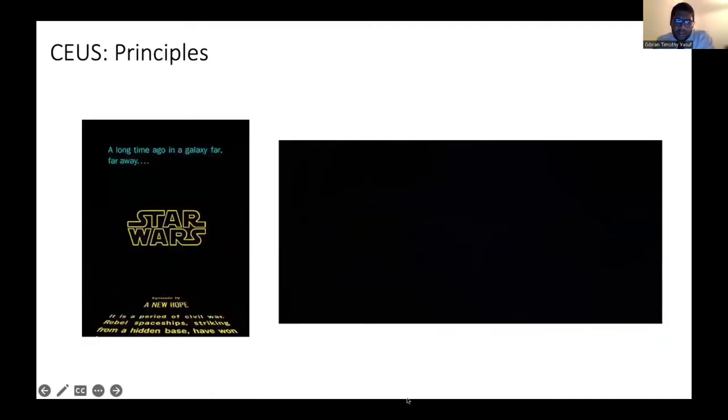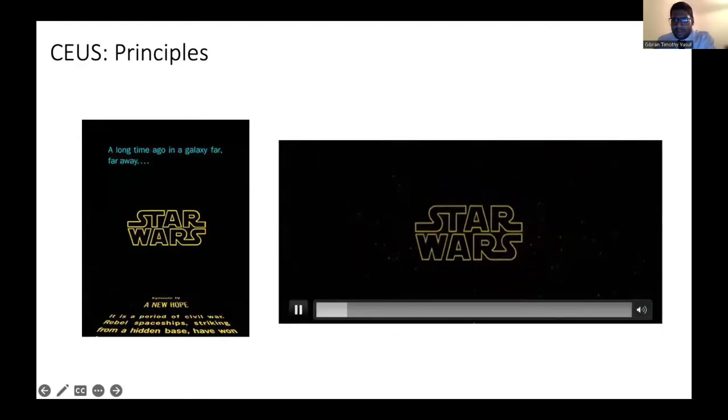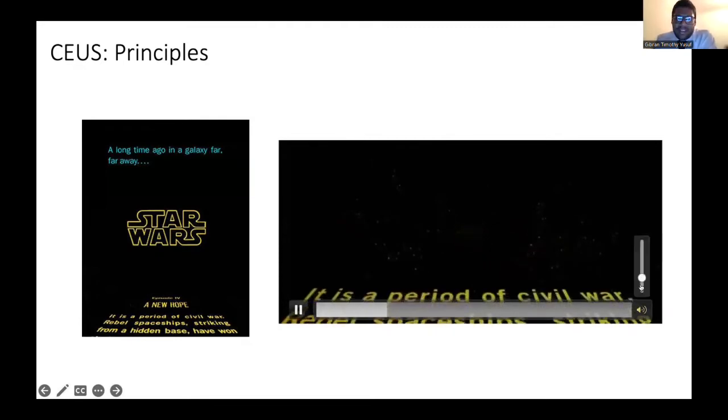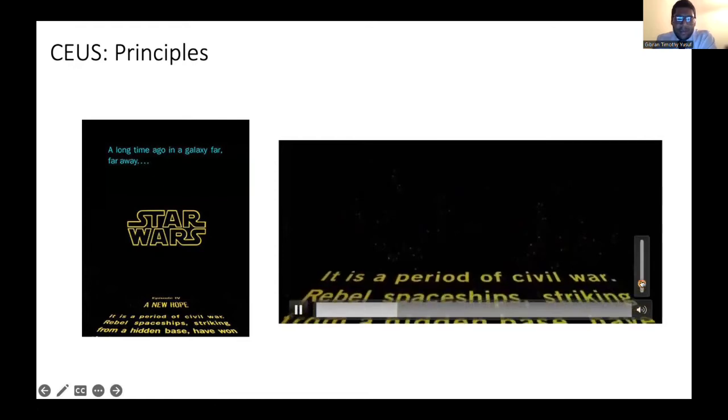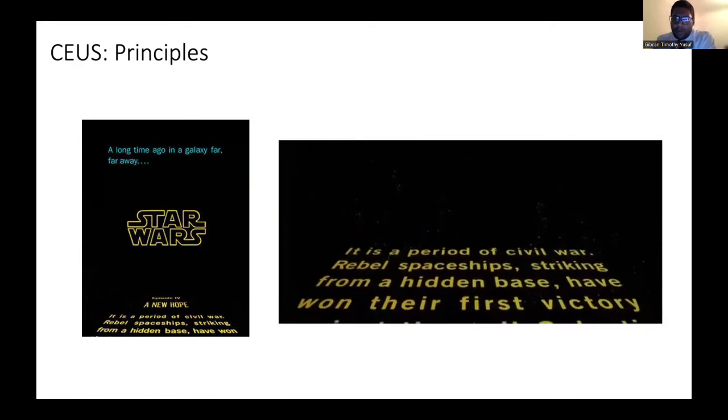But why should you do it? What's the real benefit? The real benefit of contrast enhanced ultrasound is that you can see a movie. You don't just see a picture. You get to watch something all the way through.